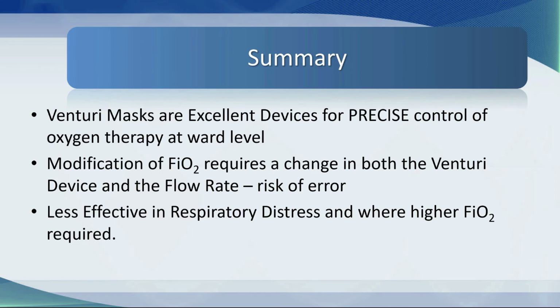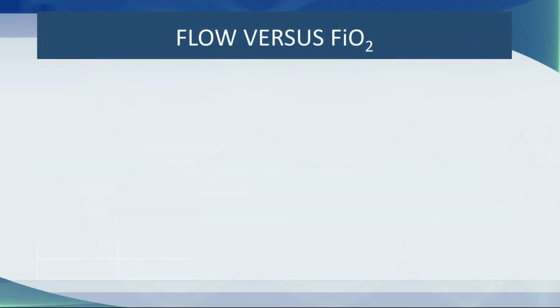And there is a risk of error. For example, that somebody might put in a Venturi and turn on the wrong flow. And that does make it a little bit problematic. And they really are not as effective in severe respiratory distress.